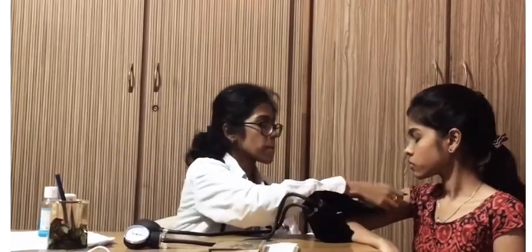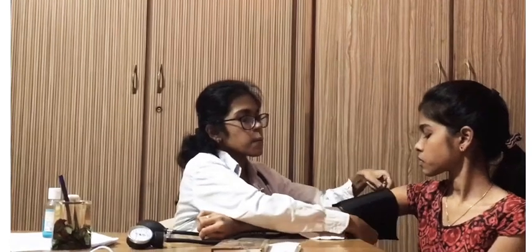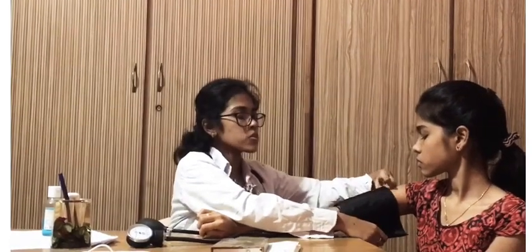Make sure the cuff of the sphygmomanometer is appropriate for the size of the arm. Make sure there's a two-finger gap between the cuff and the arm.